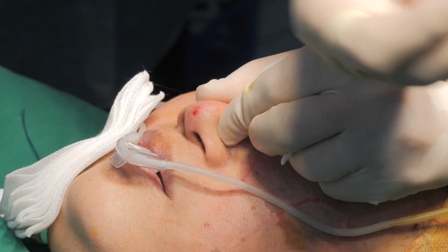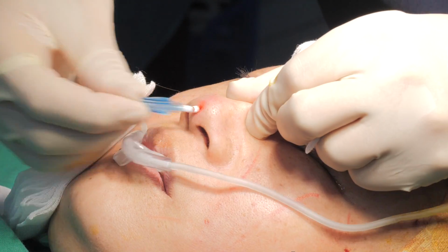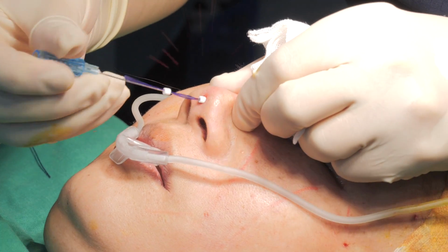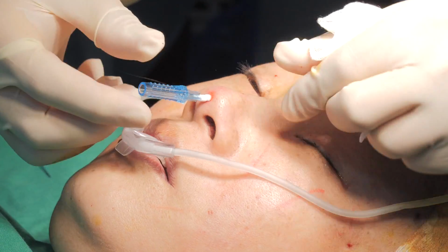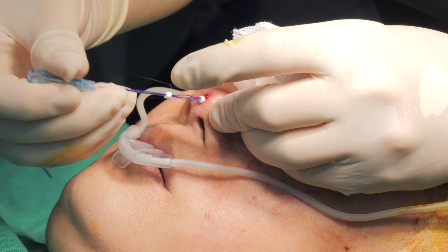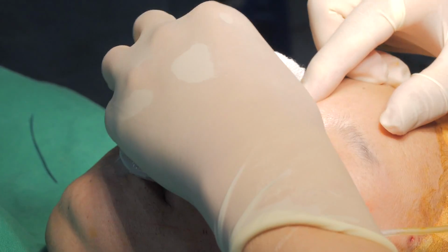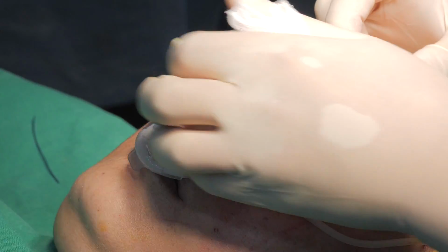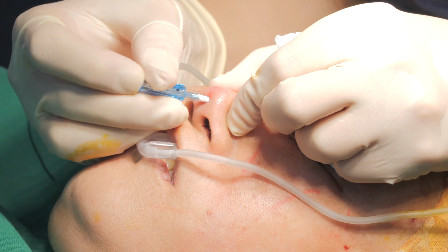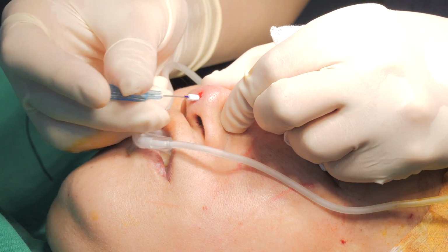Okay, so you're inserting a multi-line and then a multi-line, to fill the supratip depression. And what about inserting a multi-line on the nasal tip?